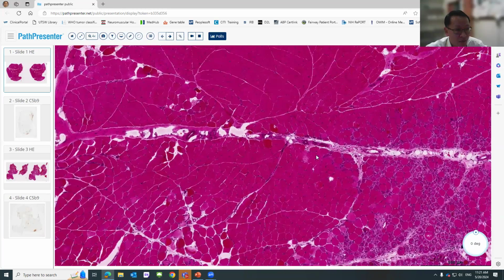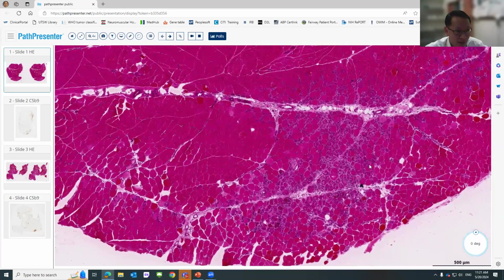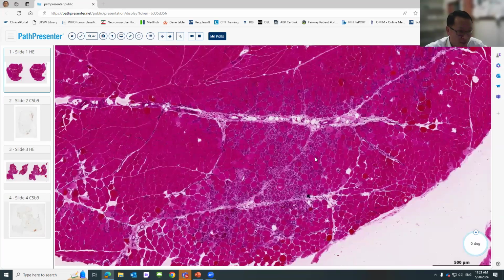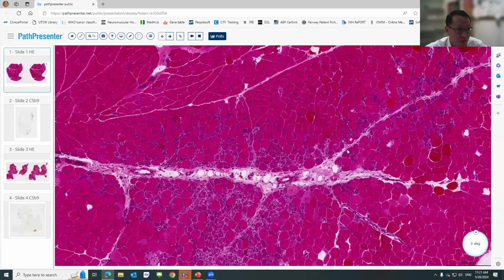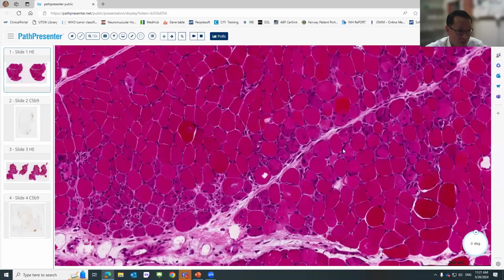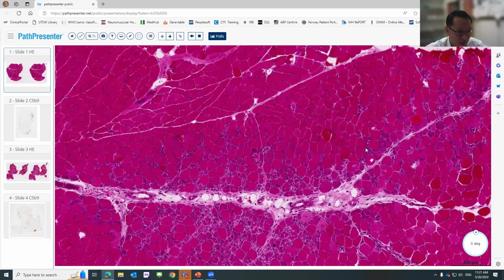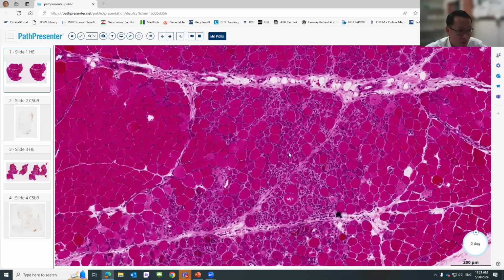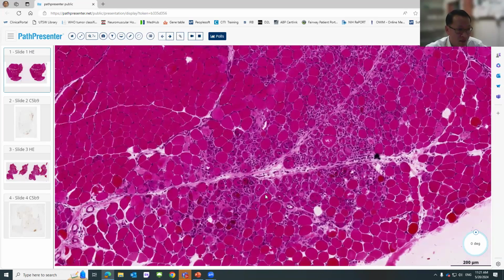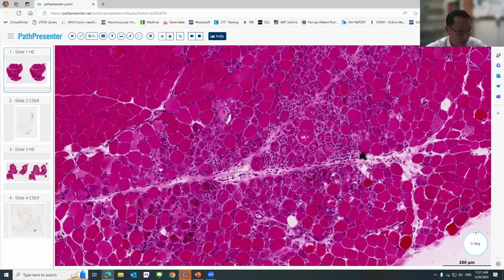And then in the involved area, it's like a nuclear bomb has been thrown there. It's very massive destruction. And if you look closely, you can see all these necrotic and regenerating fibers. They kind of track along the perimysium. And in some areas, they can expand more interiorly, so they have a more nodular kind of distribution there, but generally still follow the perifascicular distribution.